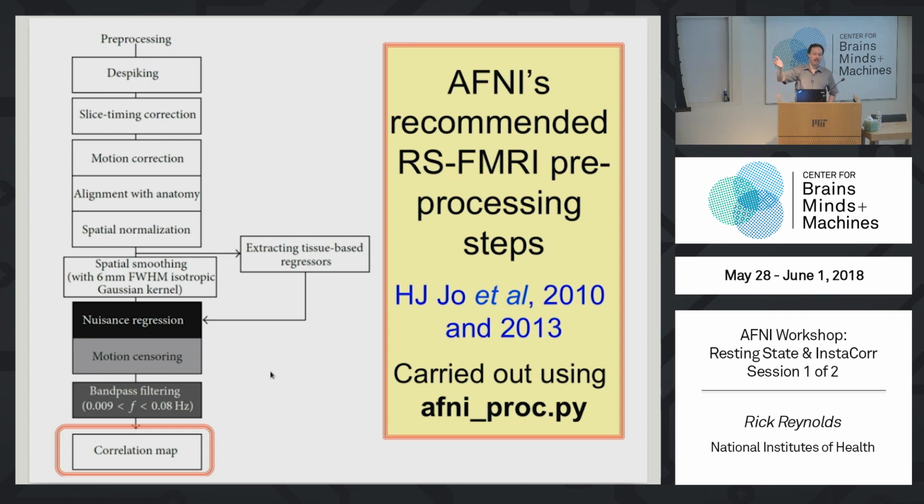And in the cases where it's not a BOLD effect, you won't have that exponential decay. So that gives you a little more information with the multiple echoes, and then maybe we trust it a little bit more. But that's the only ICA we do. And afni_proc.py incorporates MICA, the multi-echo ICA, if you're interested in that. If you don't have multi-echo data, then of course not.